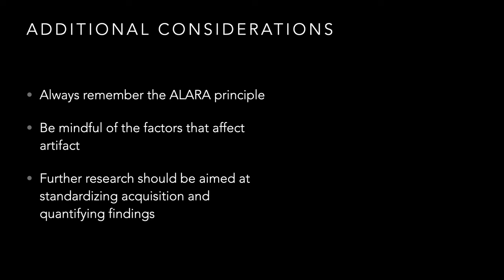And there are going to be advantages there in that it will start standardizing our assessment, because historically ultrasound has been very operator dependent. Well, maybe we can take some of that operator dependency out of the equation with AI. However, as everyone who's involved in creating AIs would say, these models are only as good as the data that they're being fed, right? And so if we're feeding it a heterogeneous data set, that's going to affect the outcomes that we're going to be able to get.